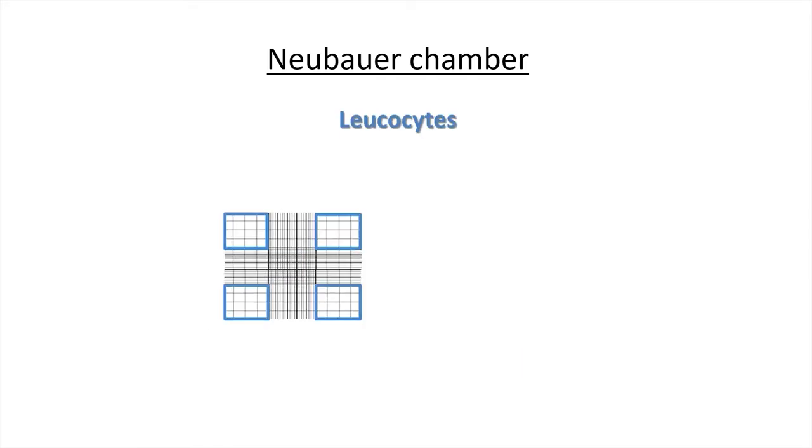The side squares will be used for the leukocyte or white blood count. Each of them is divided into 16 small squares.